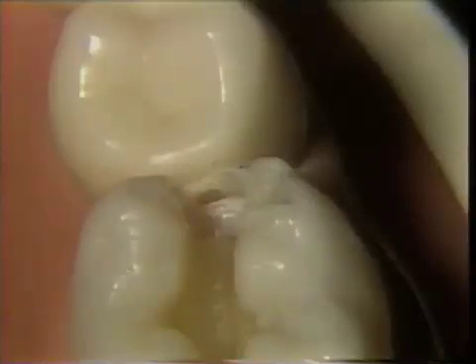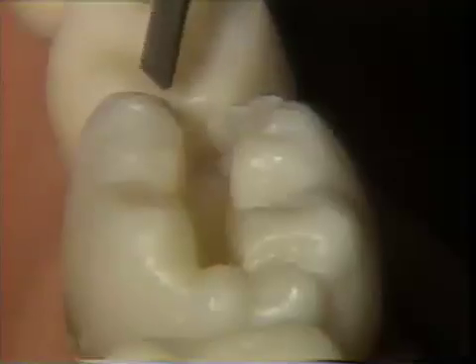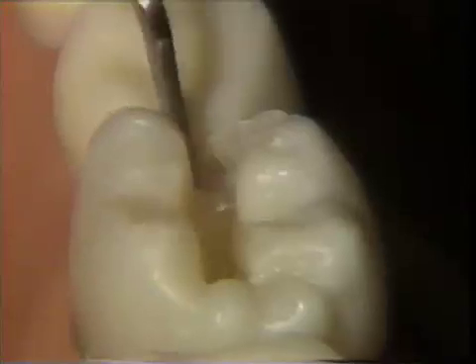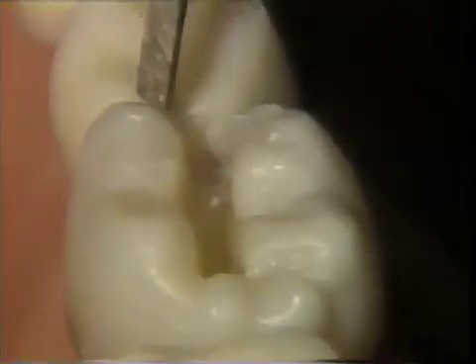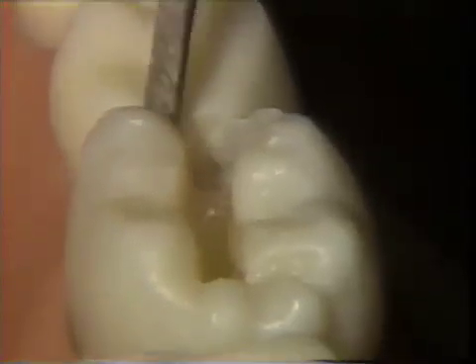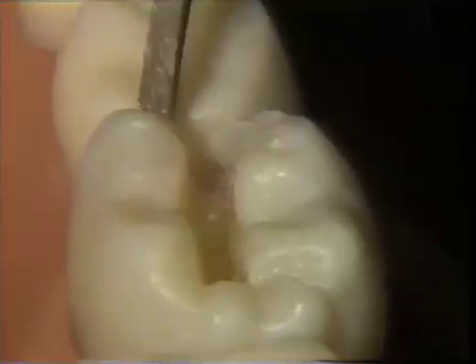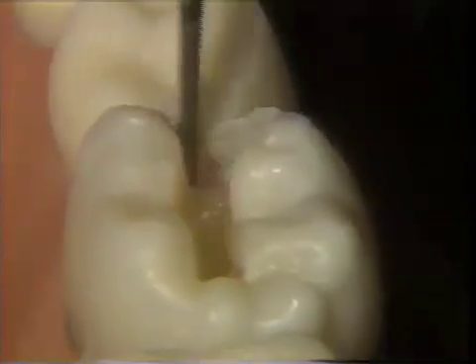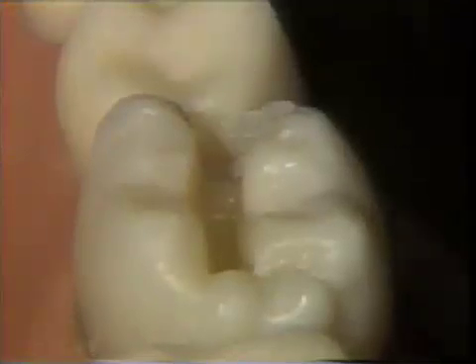Note the hole in the marginal ridge. An enamel hatchet is used to accomplish four objectives in this cavity preparation: first, to extend the proximal walls; second, to place the proper flare on the proximal walls; third, to prepare the cavosurface margins of the proximal walls for acceptance of the restorative material; and fourth, to smooth the cervical floor.